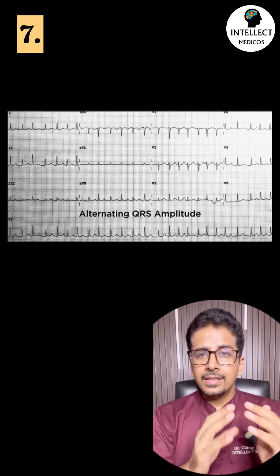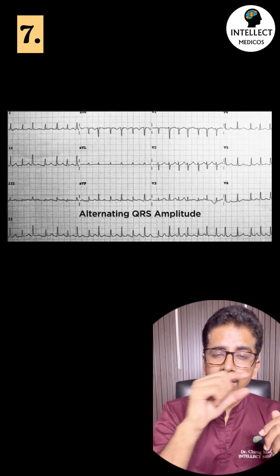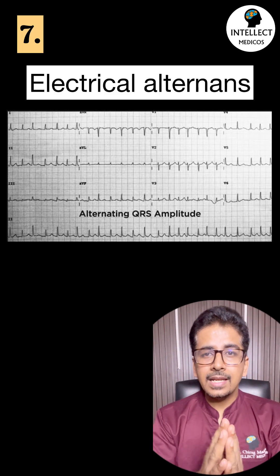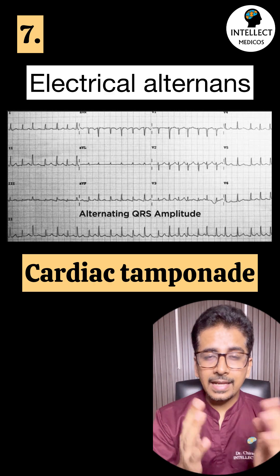Seventh: there is alternating QRS complex, which is called electrical alternans, seen in cardiac tamponade.